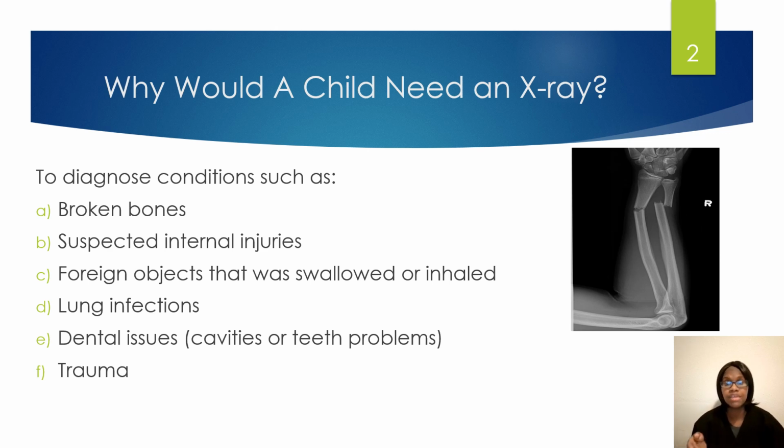So I would just make it fun. I would tell the child that it's just a big camera, make sure they smile and hold still for the picture so that it can just help them ease the stress of the x-ray and what to expect.